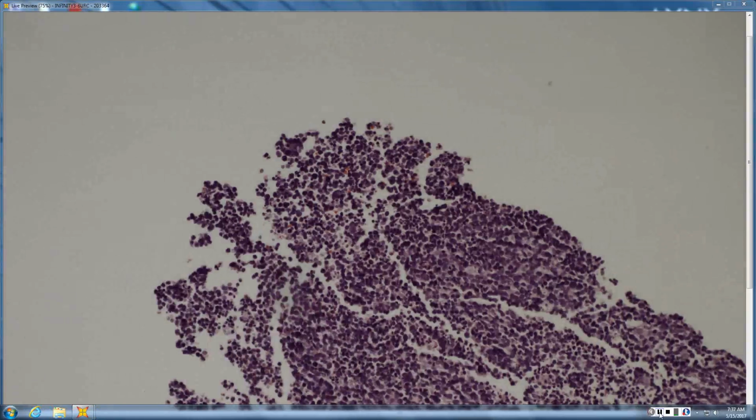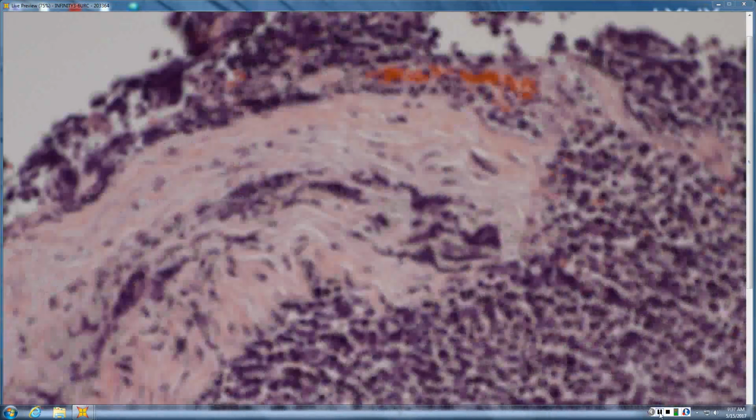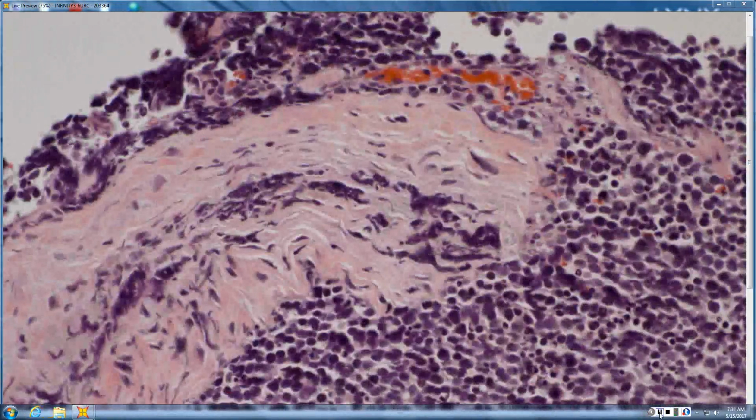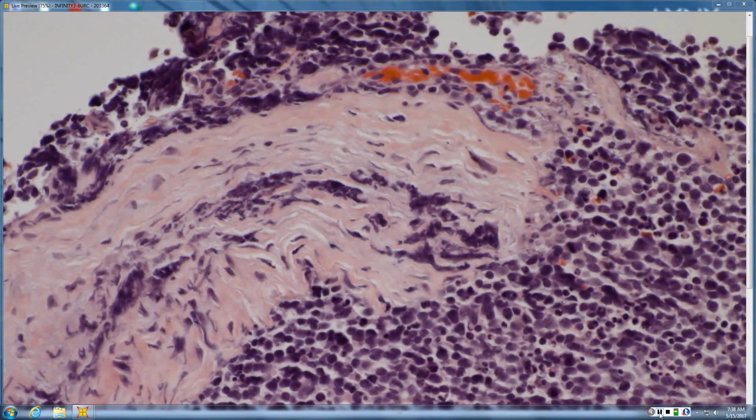So, broken pieces of neoplastic-looking tissue. Yeah, so pattern may be tough, but if you had to characterize the cells, the cytology, where would you put this? I mean, I guess there's some areas where they seem to be like boxcarring and nuclear molding. I'd worry about just breast because it's common on the skin. Sure. A little bit of nuclear molding like boxcars, single file.